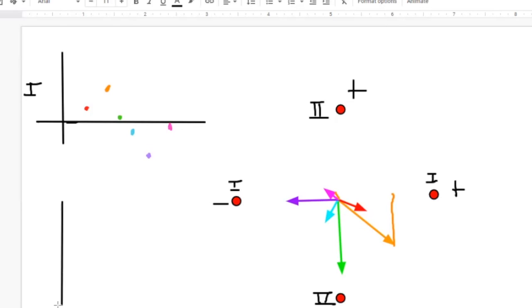Does anybody know what this collection of vectors is called? A vector cardiogram. Okay, let's blitz through. I'm just going to do it in one color for lead 2, and remember, that's positive top, negative bottom. So red vector, positive or negative? Small negative perhaps.